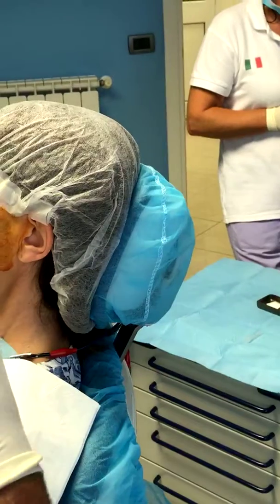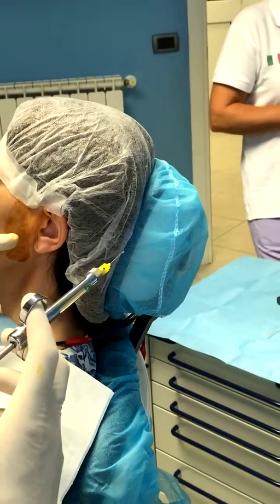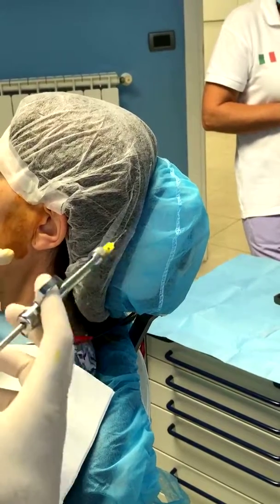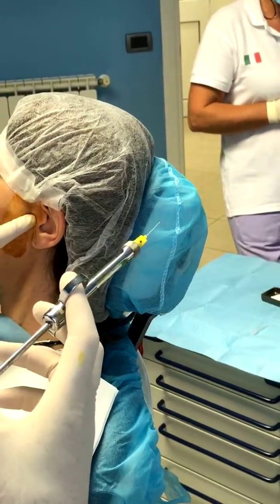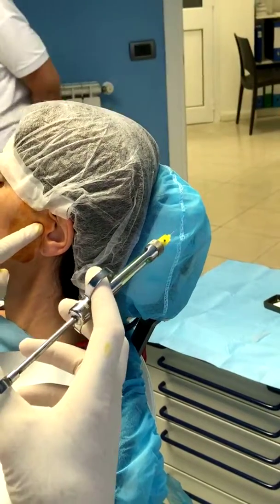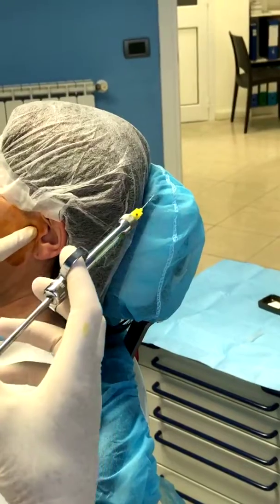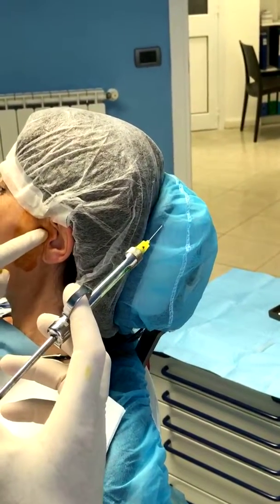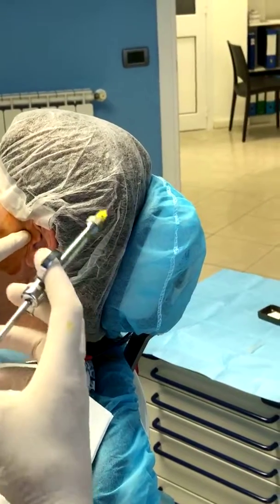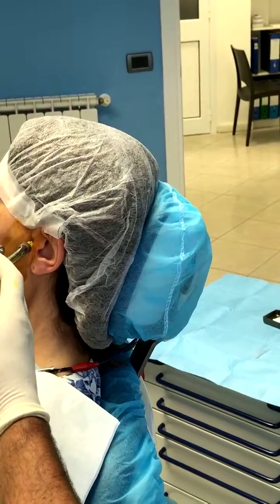Now what you do is just ask the patient to open — with this it's very important to get the right point. Here you keep the tissue apart. Here is the point; you can feel it exactly. So you go directly into the joint.